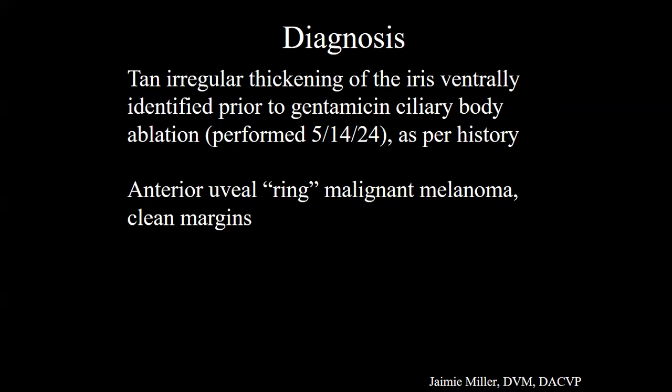And I think that often benign neoplastic cells really don't like that. And so we have seen atypical malignant versions of benign tumors in these cases. More commonly in unrecognized iridociliary adenoma that presents more malignant features, melanocytic tumors like that. So, yeah, that's mainly it.